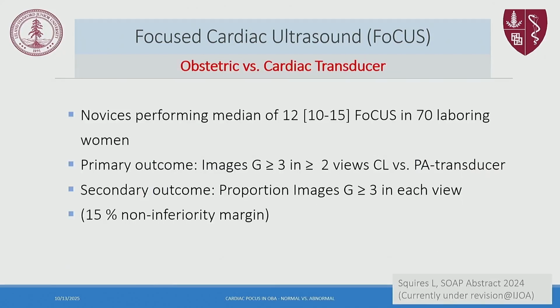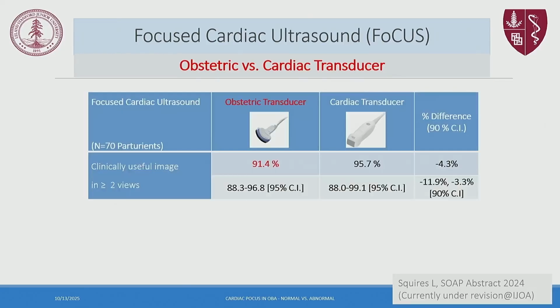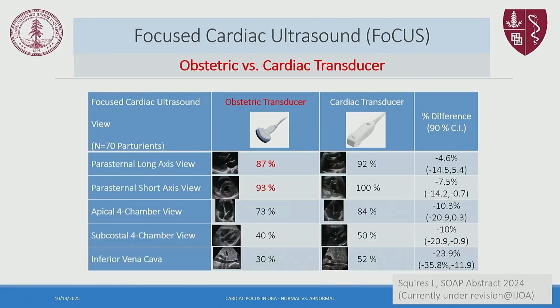And then if you say, okay, unfortunately we have no cardiac transducer, we also studied whether we can actually use an obstetric transducer for focused cardiac ultrasound. Also with our novices, our fellows, we randomized 70 laboring patients to perform a focused cardiac ultrasound using an obstetric versus a cardiac transducer. In 90% of our patients, using just the obstetric transducer, we were able to get at least 2 clinically useful images in 2 different views, okay?